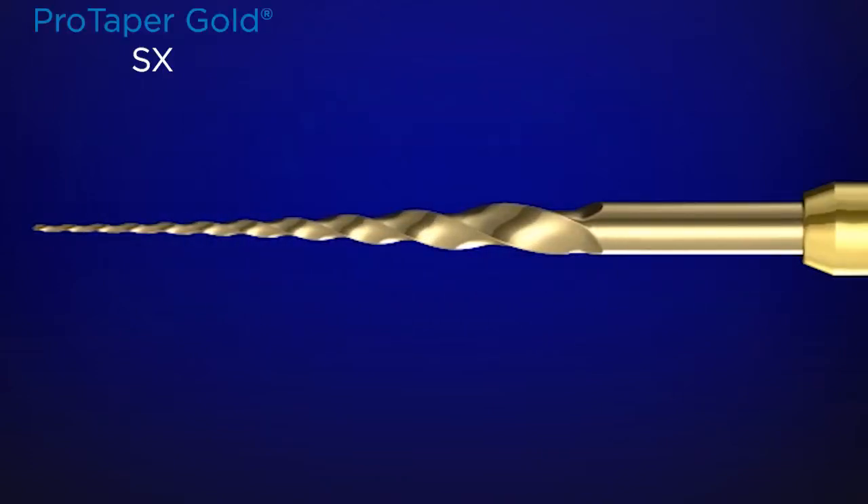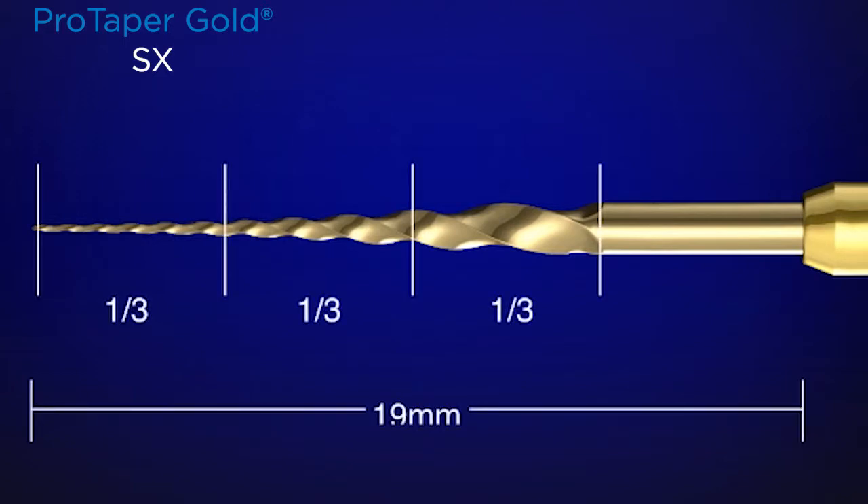Looking closer at the active portion, we can divide the instrument into thirds. It's only 19 millimeters long from the D0, or tip of the instrument, to where the shaft meets the handle. The last third — the more distal third of the instrument — is really not to cut. It's to follow along the glide path that you've either secured, or that already exists.